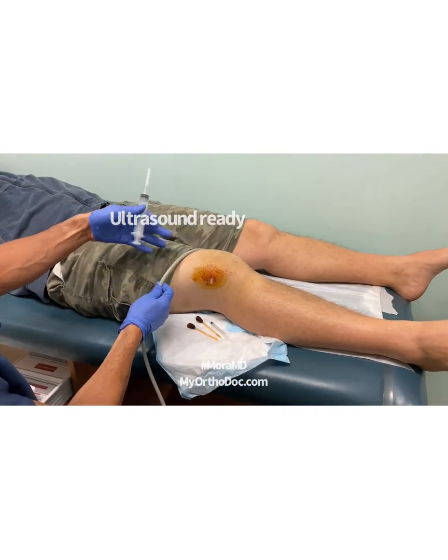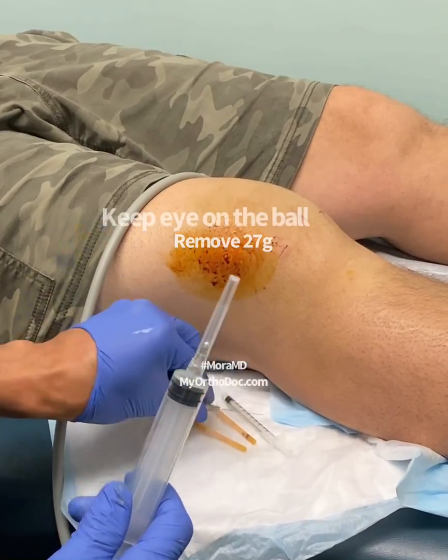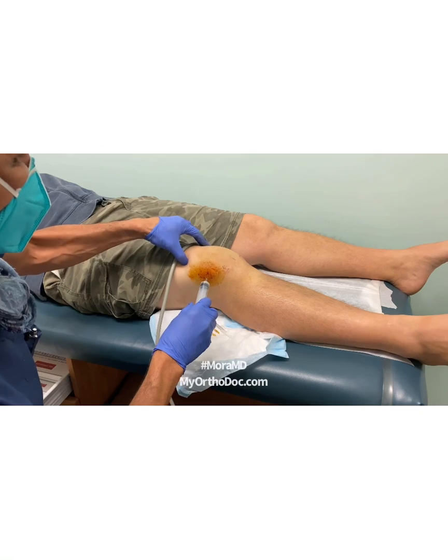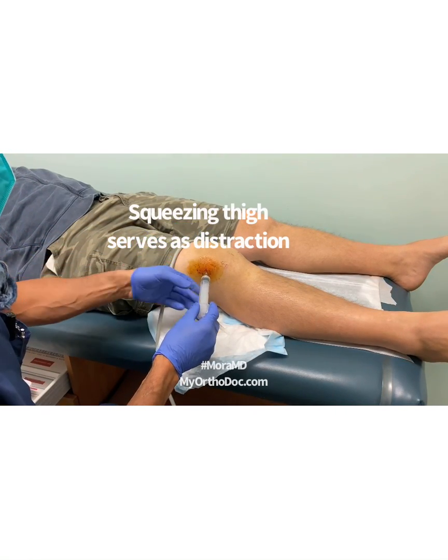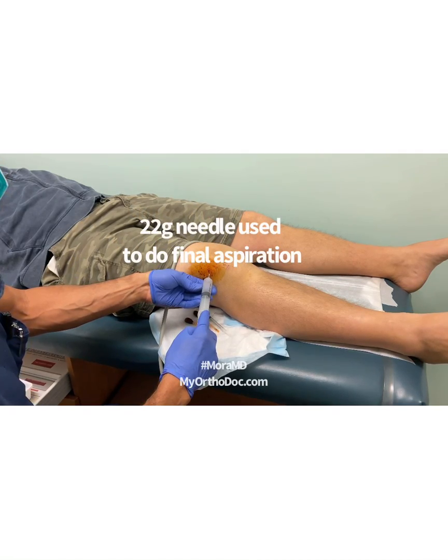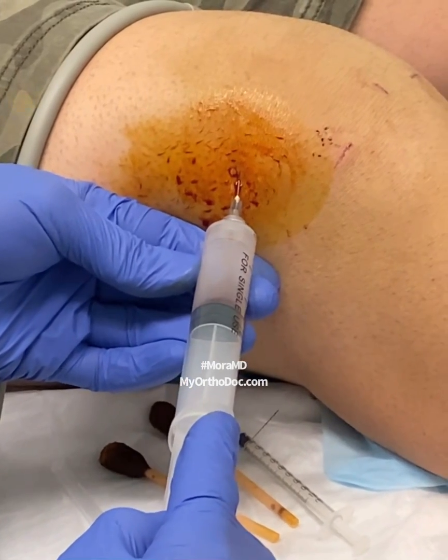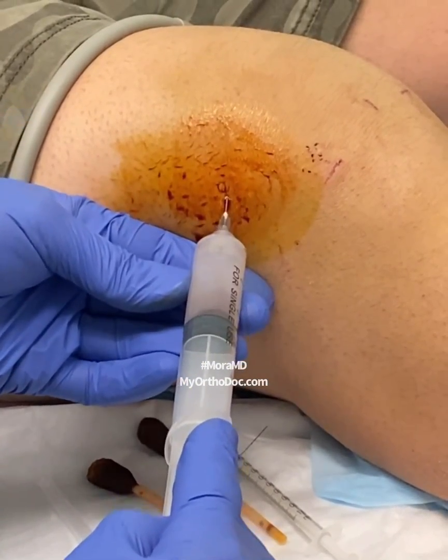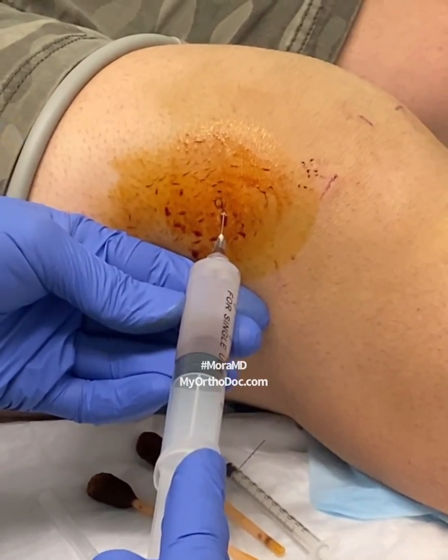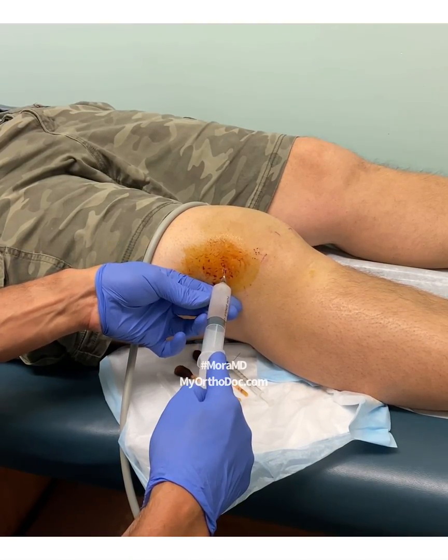I'm letting the lidocaine work — that's why I'm taking my time. I get my ultrasound ready, confirm my trajectory, remove it, and keep my eye on the ball. There it is. I go in, and at this point I really don't need the ultrasound because I'm already aspirating. There's fluid — there it is — it's blood. It's coming out slowly because it's a 22-gauge needle.